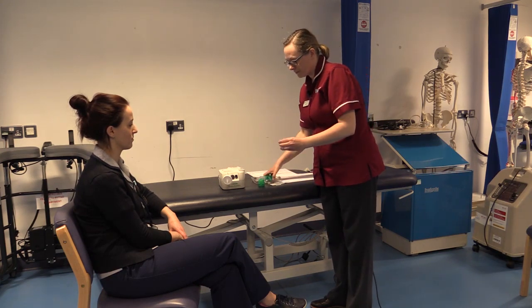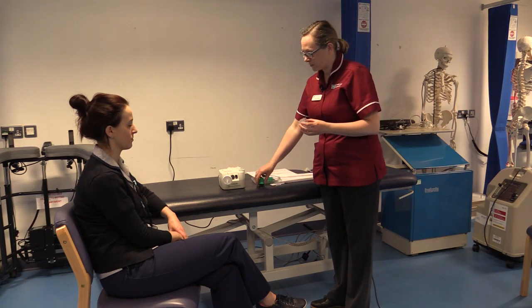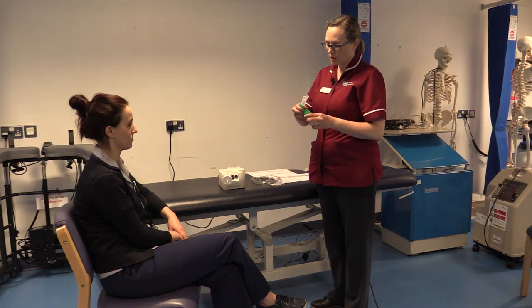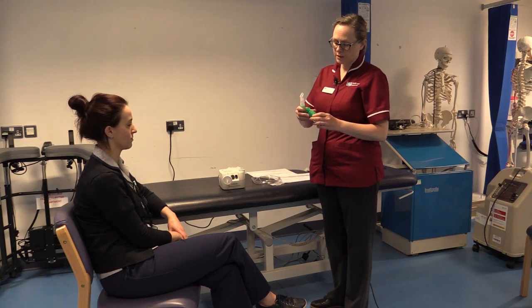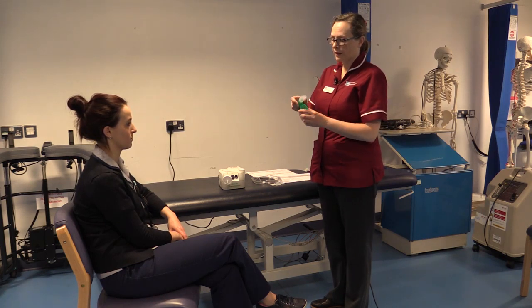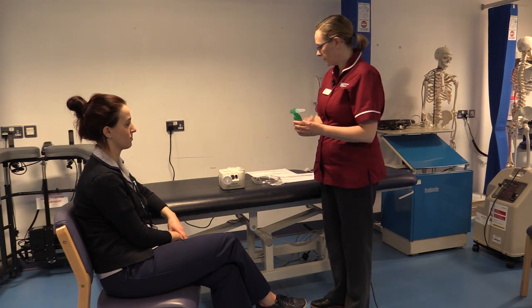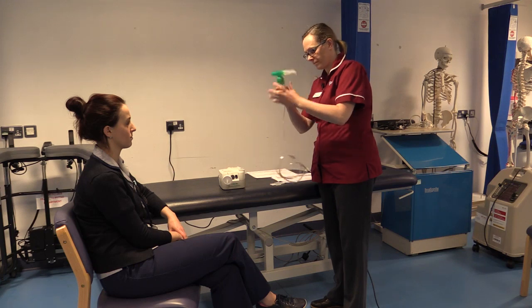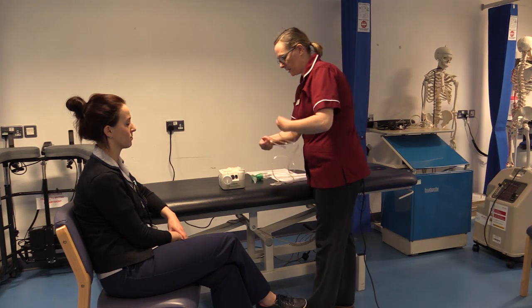Within the acorn there is a little valve. These 3 parts must be together for it to function properly. After each use, this should be taken apart and rinsed and dried and put back together ready for the next dose. And the mouthpiece sits on top. The tubing attaches at the bottom and then to the nebuliser.